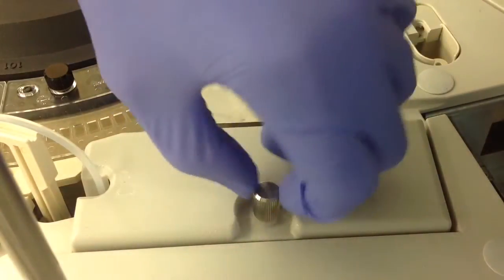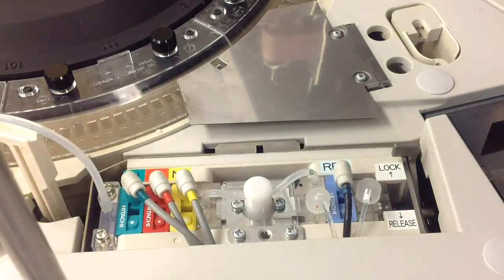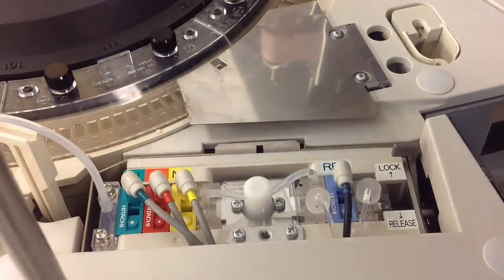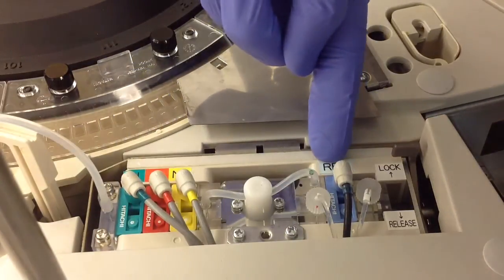The first thing you have to go ahead and do is remove the lid that covers the measuring cartridges. This lid will cover the measuring cartridges here on the left and the reference cartridge here on the right.